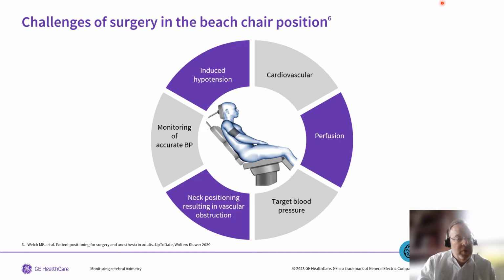In terms of perfusion risks, general anesthesia blunts systemic vascular resistance compensation, so the blood pressure overall is lower. We also shift the lower limits of brain autoregulation under anesthesia, and we'll talk about that in a little more detail later.